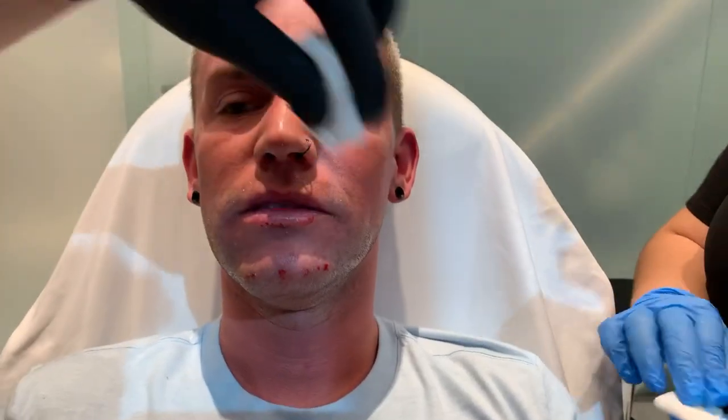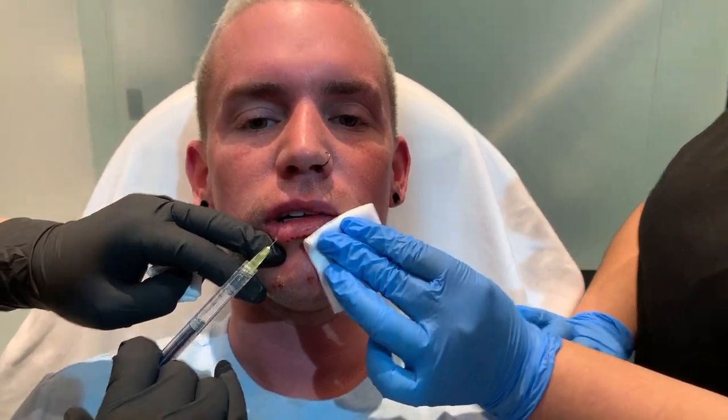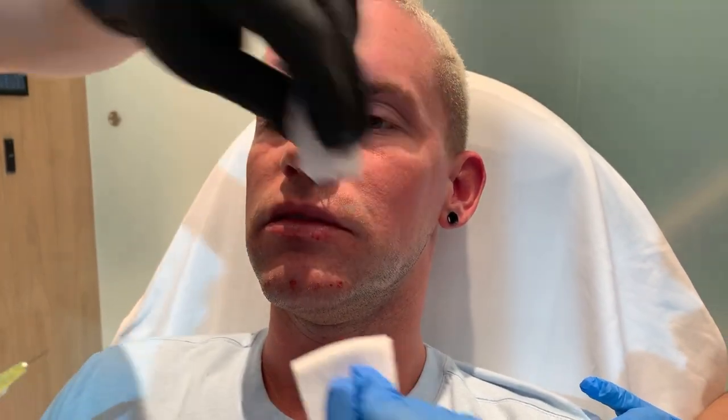So let me take a look. Now the bottom looks much more balanced. We don't want to widen it too much, but I definitely want volume there. But what I love about Kysse is, you know, it's softer, but it still allows me to give a little bit of volume. Okay? All right, perfect.